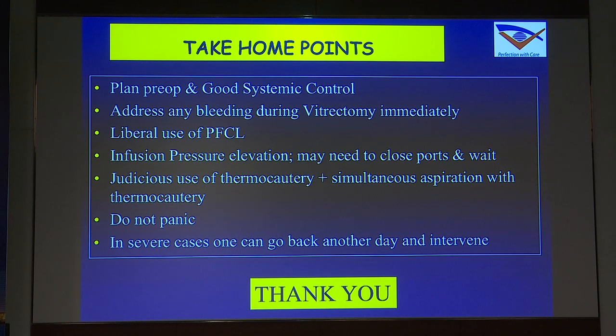So the take-home message is: must plan well preoperatively, have good systemic control, and address any bleeding during vitrectomy immediately. There should be liberal use of perfluorocarbons. Infusion pressure must be elevated for a short duration of time till you can control the bleeding. You may need to close the port. Fold up your hands. Do not panic. Plan for the next steps.